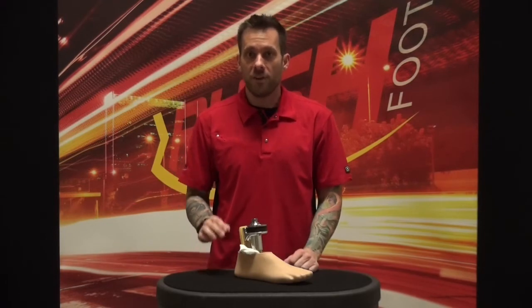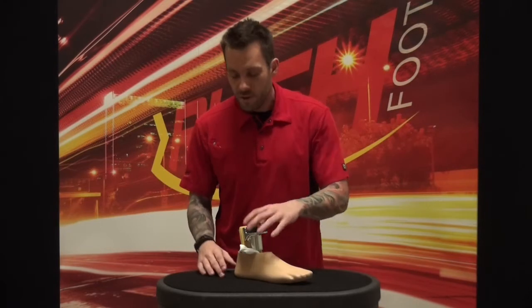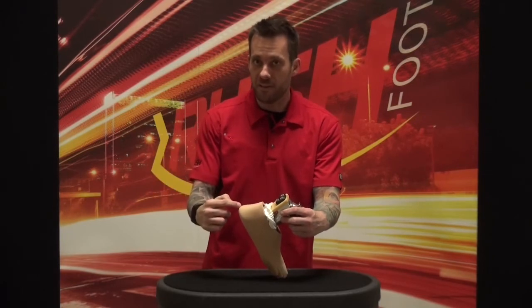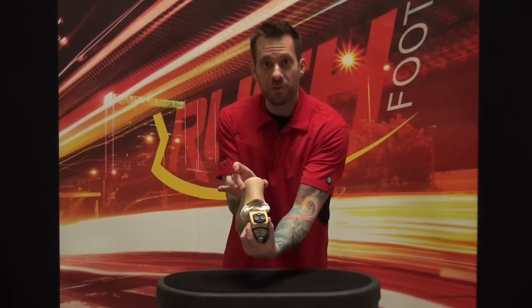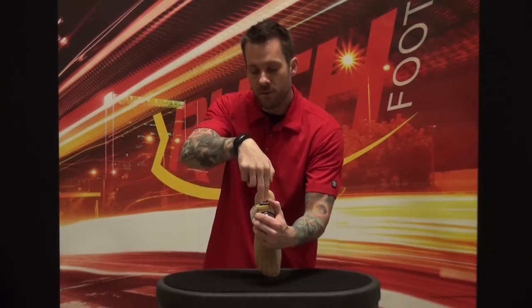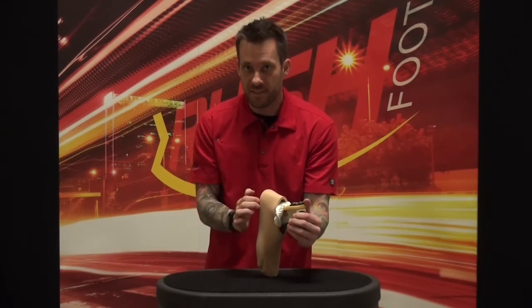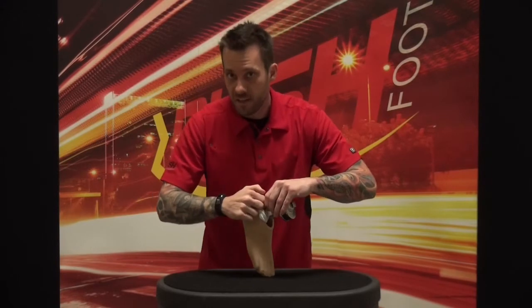Now let's talk about doffing, or removing the foot shell. Again, this is fairly easy to do. Now the key is you don't want to grab the most posterior aspect and just pull straight back, because that lip is thickest right there, and when you're pulling back it's actually causing the sides to bite in and hold it even tighter. So what I recommend doing is, instead of coming here, roll yourself towards the ankle just a little bit and pull that way so that the thin area of the lip disengages, and then it walks itself off in reverse.